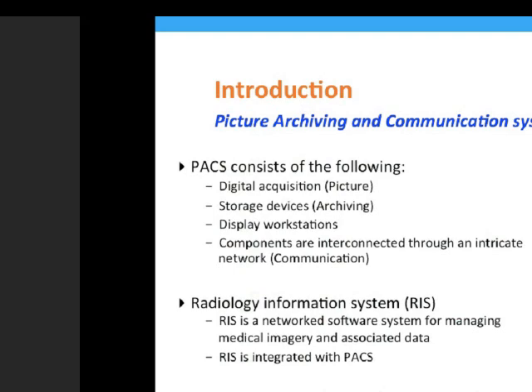And obviously, the entire process of this information flow is based on the image format, which is called the DICOM image format.